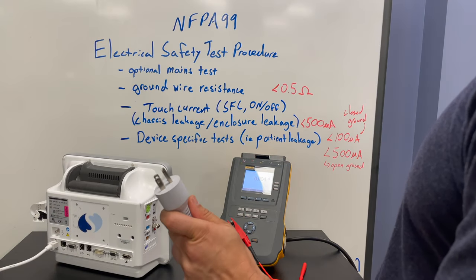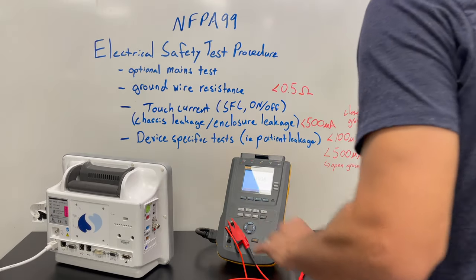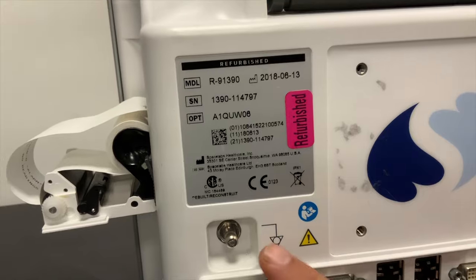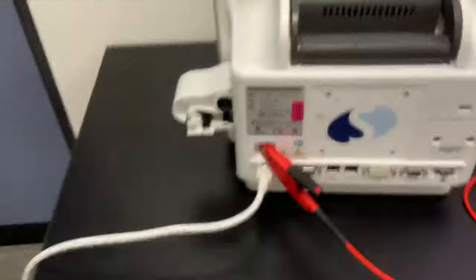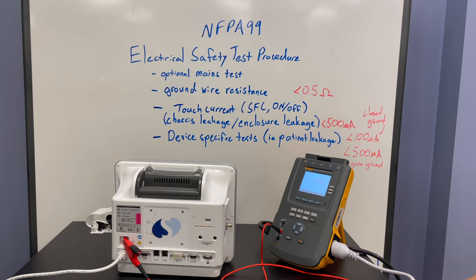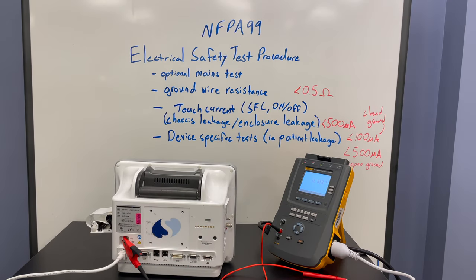We have our power cord here — plug that into our electrical safety analyzer. Now we're going to measure. Looking at our medical device, we can spot the ground connection right there. Hook up the alligator clip to that ground connection. We're measuring 0.1 ohms, which is less than our 0.5 ohm requirement.